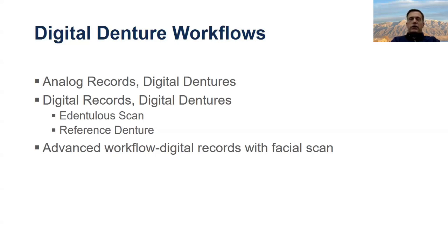If you have a patient who doesn't have a denture or won't bring it, and you want to do a more advanced workflow and get to 3 appointments, you can get an impression and take a mush bite. And of course, you can just add one more quick appointment and do a bite block. With that bite block, you can use the reference denture workflow. One of the cool things about the facial scanning workflow you'll see is that you can even get your digital denture workflows down to 2 appointments.